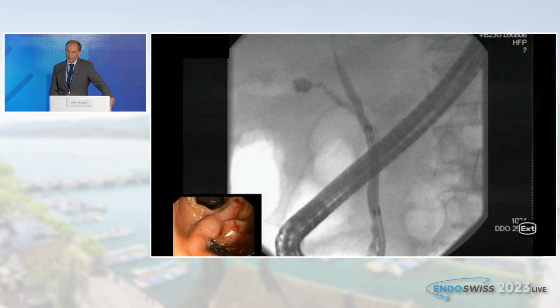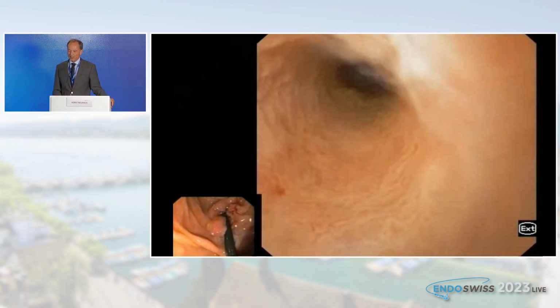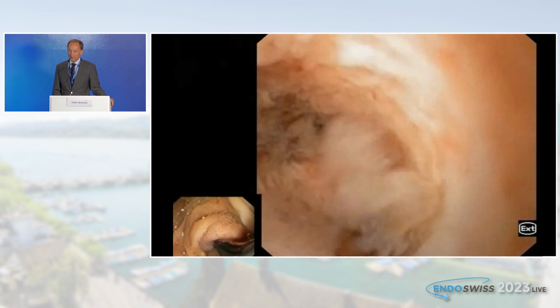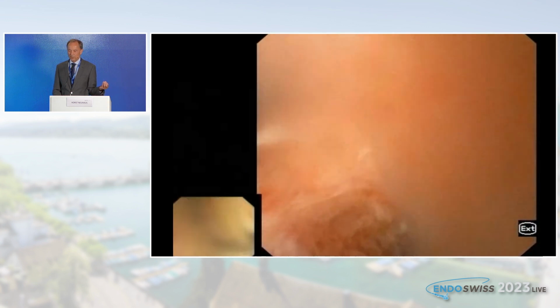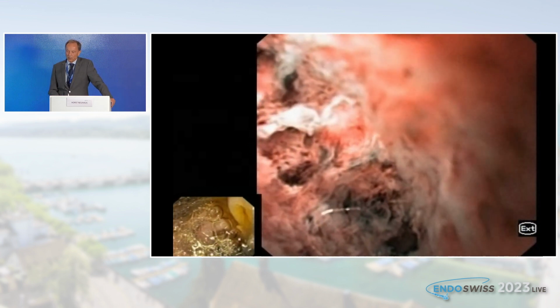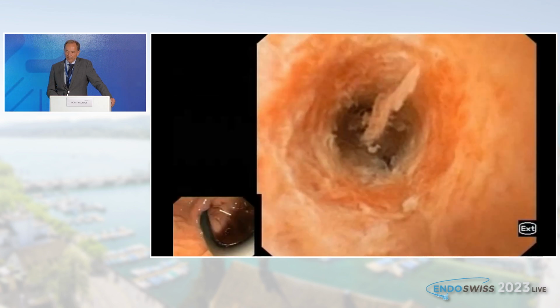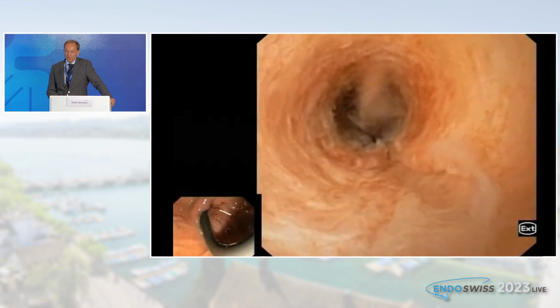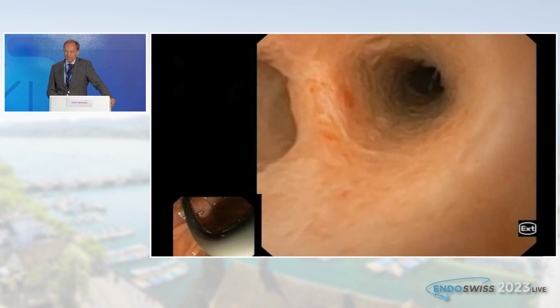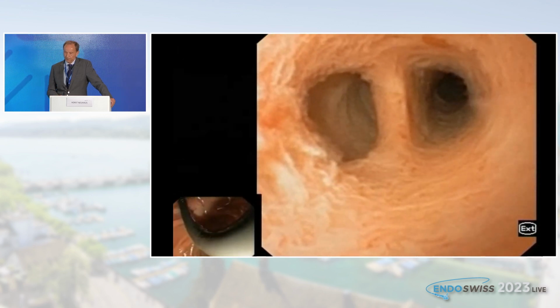So this is an example here in a patient with a hilar stenosis. We've just seen the cystic duct junction. We're approaching the hilum, and as you can see, we get an excellent image with the option of a detailed evaluation of the mucosal structure and, switching to NBI, also of the vascular structure. And here, this was a hilum. We can precisely define the intraluminal spread of the tumor. We can exclude skipping lesions coming back here to the cystic duct junction.